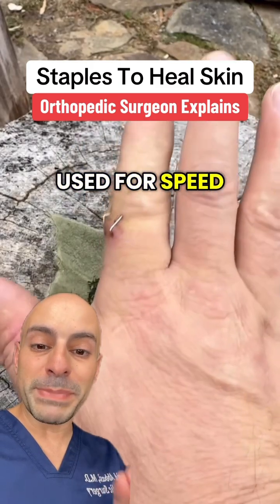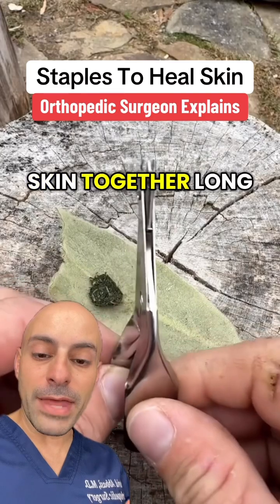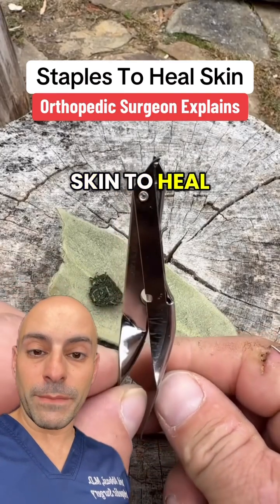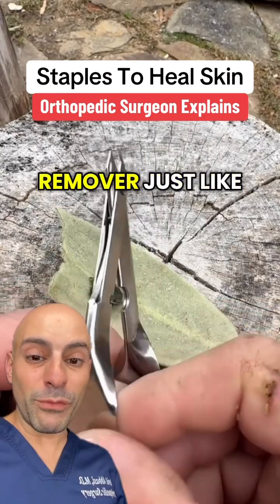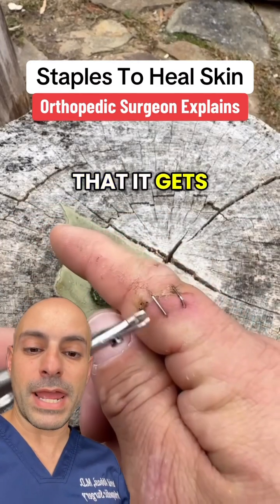Typically, they are used for speed. Basically, when we're closing an incision, the staples act to bring the skin together long enough for the skin to heal. Then we would use a staple remover just like this in about 7 to 10 days, depending on the body part and the blood flow that it gets.